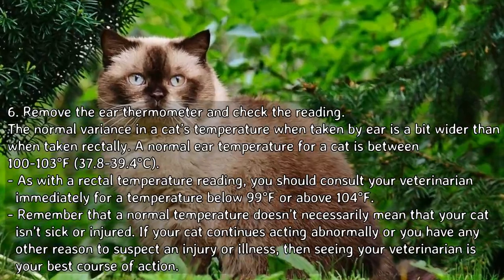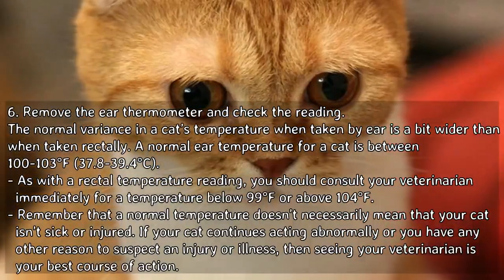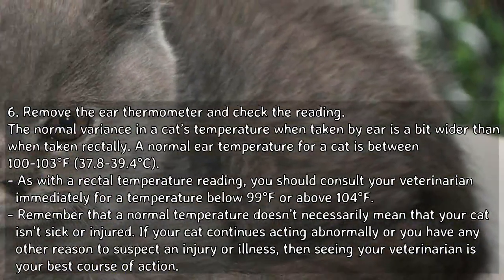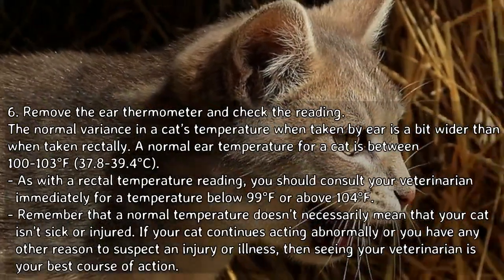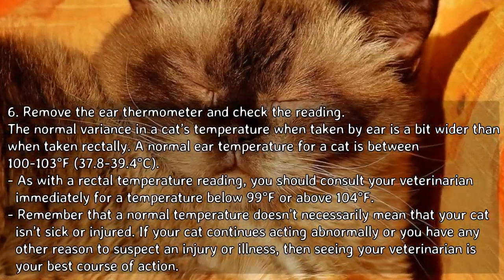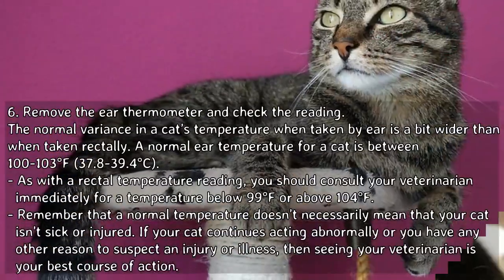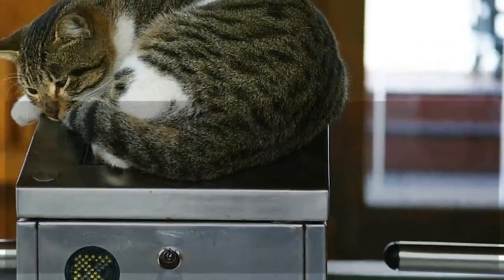Remove the ear thermometer and check the reading. The normal ear temperature for a cat is between 100 to 103°F (37.8 to 39.4°C), a slightly wider range than rectal readings. As with rectal temperature, consult your veterinarian immediately for a temperature below 99°F or above 104°F. Remember that a normal temperature doesn't necessarily mean your cat isn't sick or injured — if your cat continues acting abnormally, seeing your veterinarian is your best course of action.